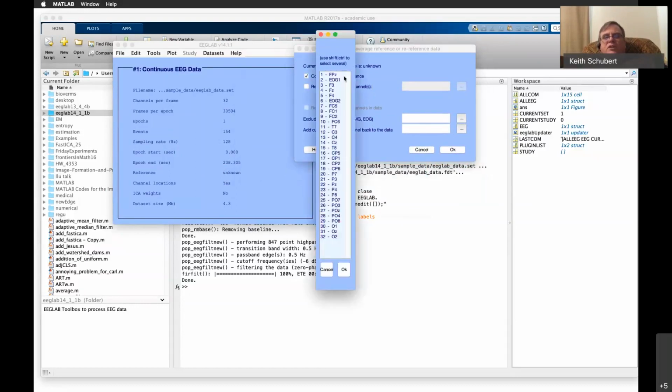If we click the list, it'll show us our particular EOG channels. Only control lets me do this.